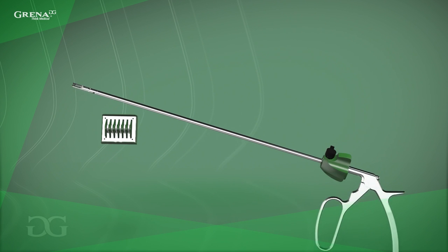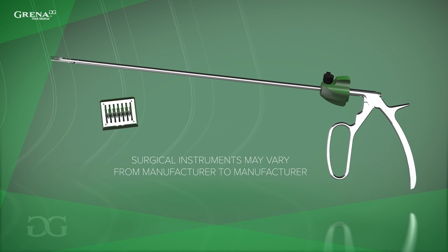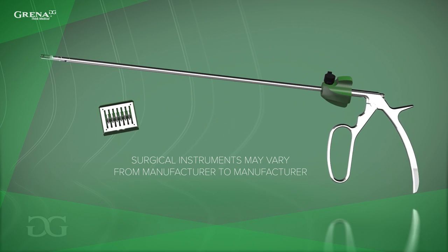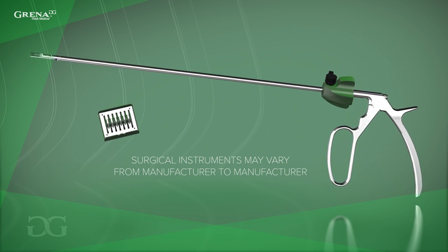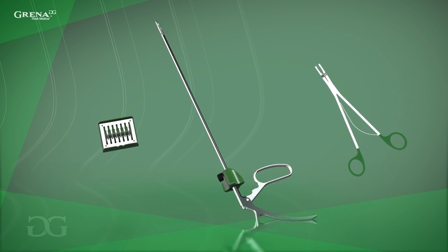Before you start, it is important to verify the compatibility of the instruments prior to the initiation of the procedure. Surgical instruments vary from manufacturer to manufacturer. For Click-A-V polymer clips, clip appliers are available for open and endosurgery.